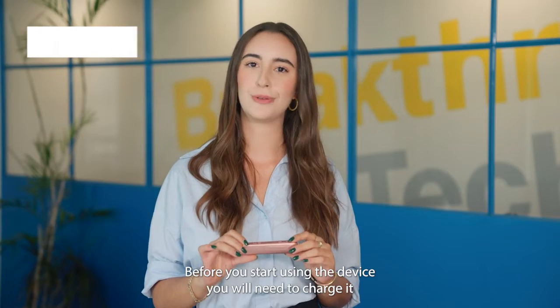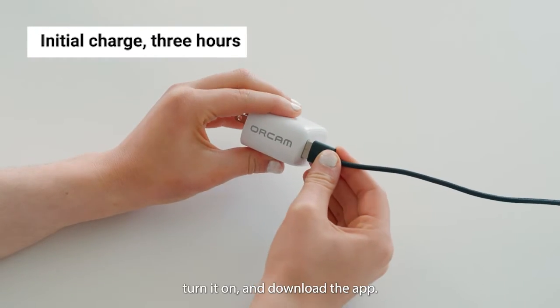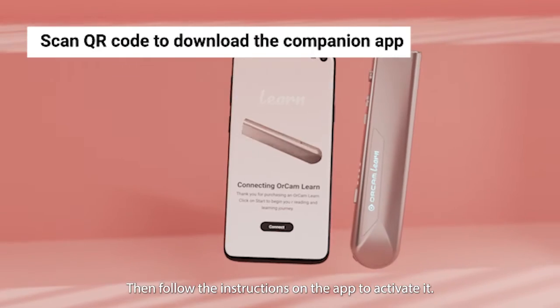Before you start using the device, you will need to charge it for about three hours. Turn it on and download the app, then follow the instructions on the app to activate it.